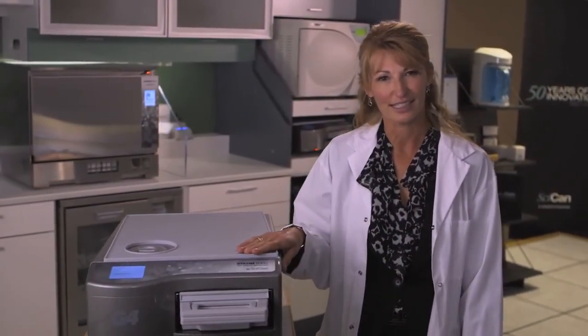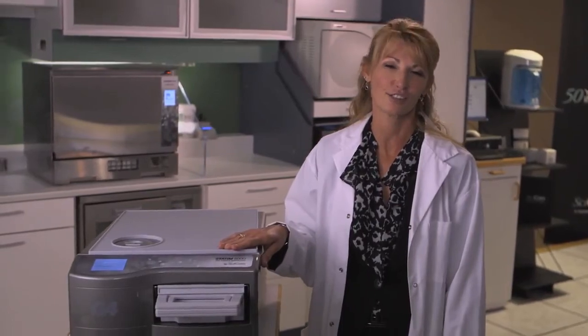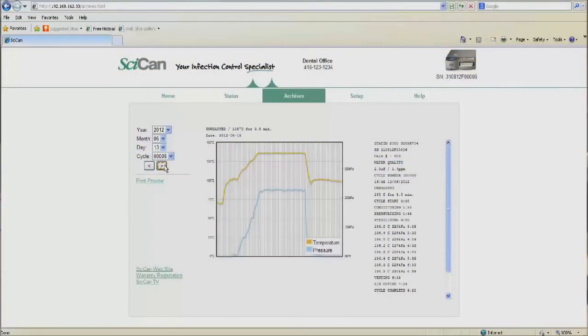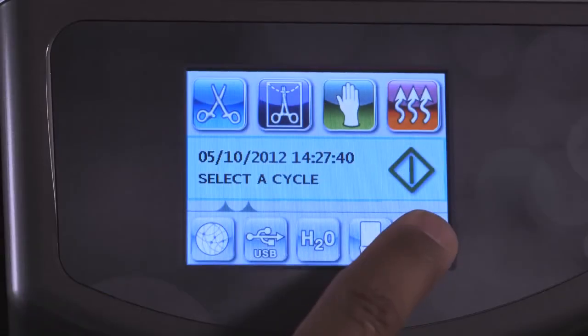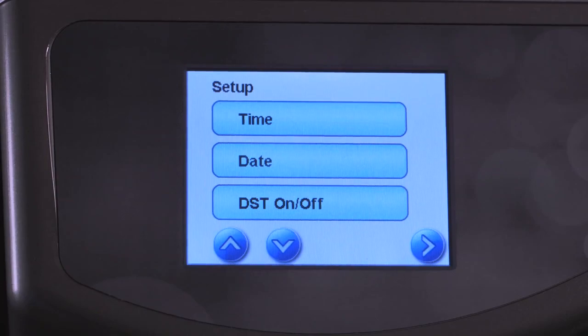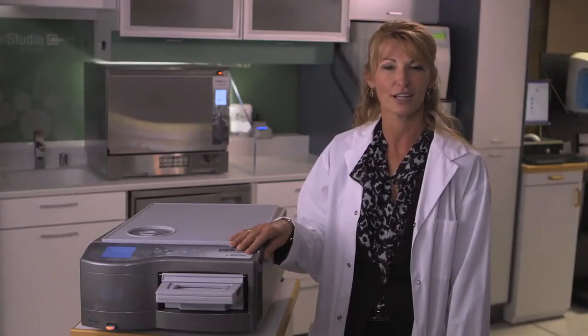The new and highly innovative Statum G4 series. Infection protection designed to ensure you have constant support — support through industry-leading connectivity, unrivaled data collection and logging, and an advanced touch screen designed to provide all the information you require at the exact moment you require it. Statum G4: the future of dental sterilization.